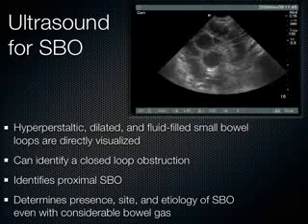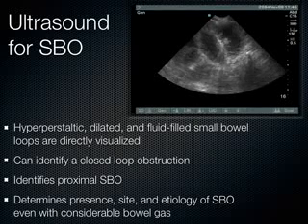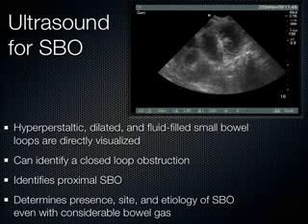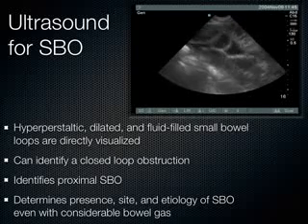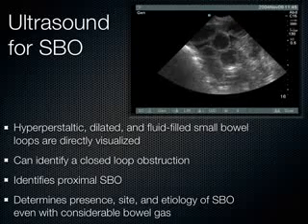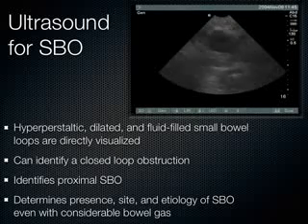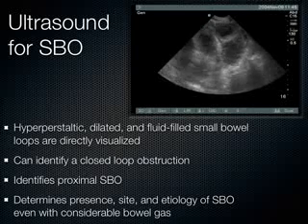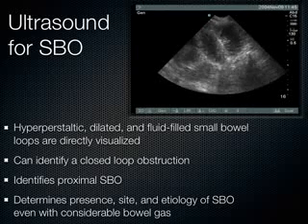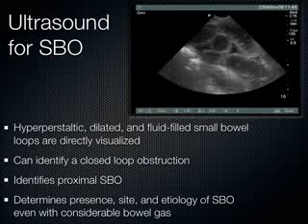So somewhere between X-ray and CT lies ultrasound with its test characteristics. And what you see with ultrasound is pretty easy to see, actually. If I've got a patient who's pretty distended, they're vomiting, they've got all the clinical signs of small bowel obstruction, I just walk over with the ultrasound probe. Well, this is what I see. I see these dilated loops of small bowel. Notice the plicae circularis going all the way across the bowel there. The walls are usually thickened, though sometimes in an early small bowel obstruction the walls have yet to become thickened.